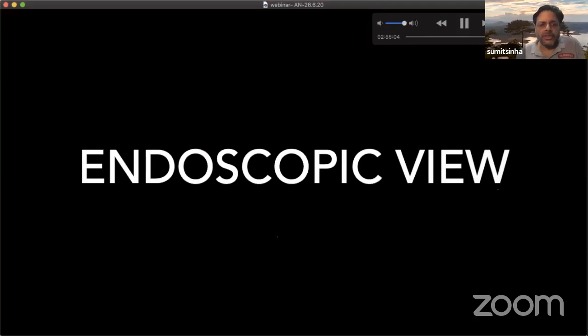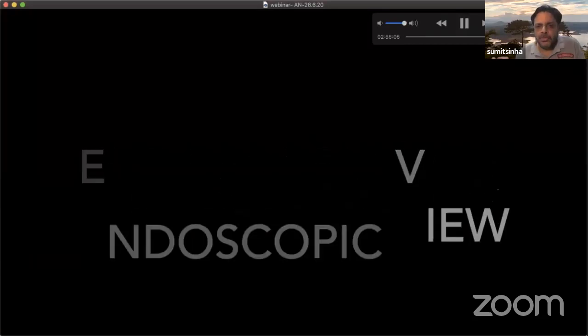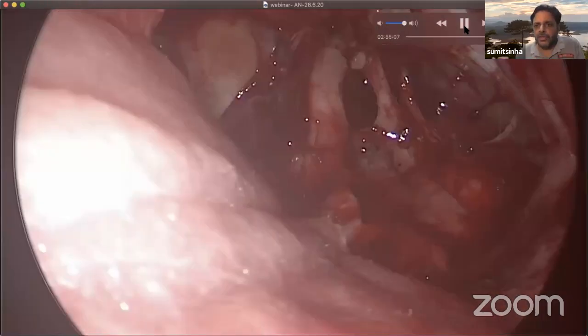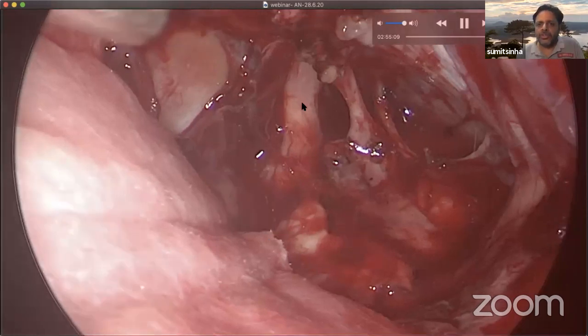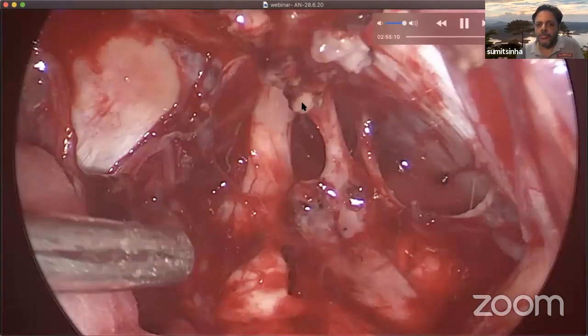At the end of the surgery, we take the endoscope inside. I should say that this is not the endoscopic view of this patient, because in this patient I was not able to take the endoscope in. My light source went bad, but I wanted to show this endoscopic view to my viewers, to show how it looks and what the advantage of taking in the endoscope is.